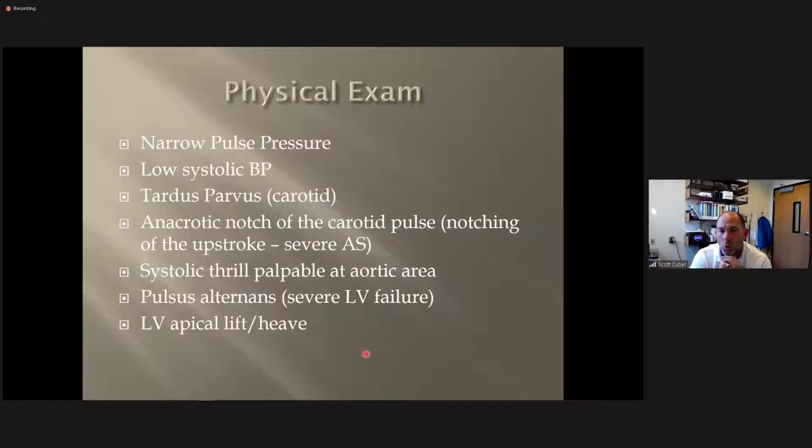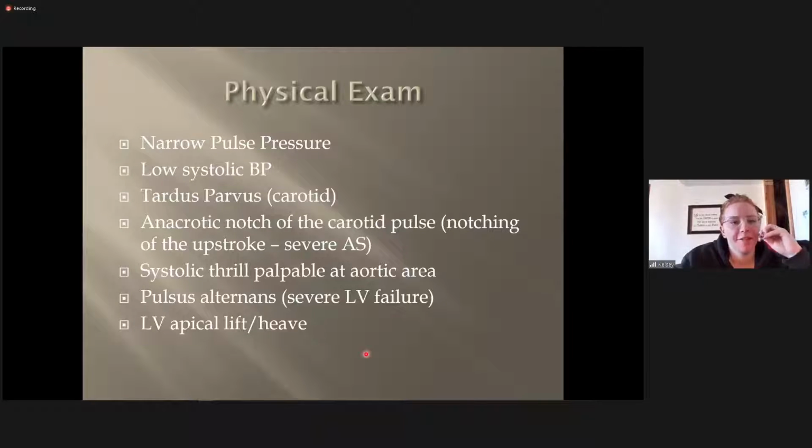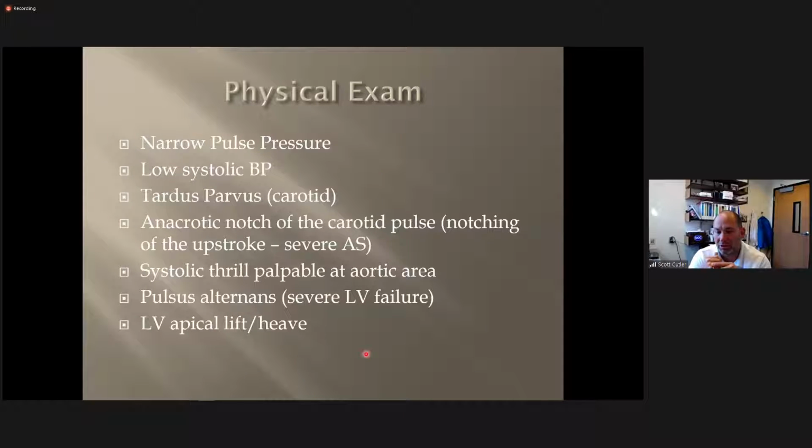It's variable. It's just one feature that might suggest that we have something going on. So if I've got my patient that's having syncopal episodes and comes in with a narrow pulse pressure, that's two things that suggest it's aortic stenosis. And regardless, I'm certainly going to be paying attention to the aortic valve anyway. But these clues might suggest that when you start scanning, you pay particularly close attention to that. Okay, I'm thinking of ER indications right now. Right. Mike, did you have a question too?